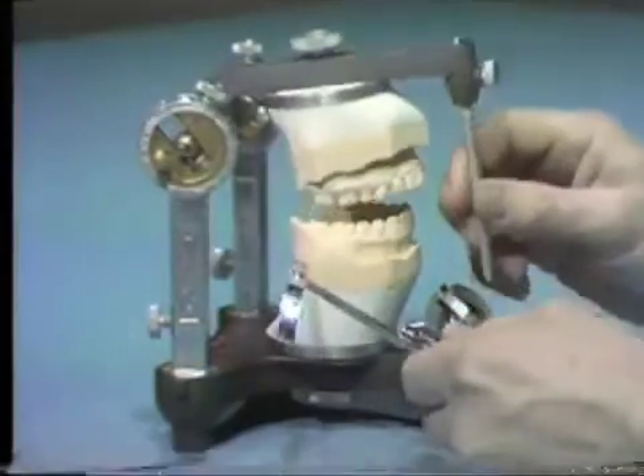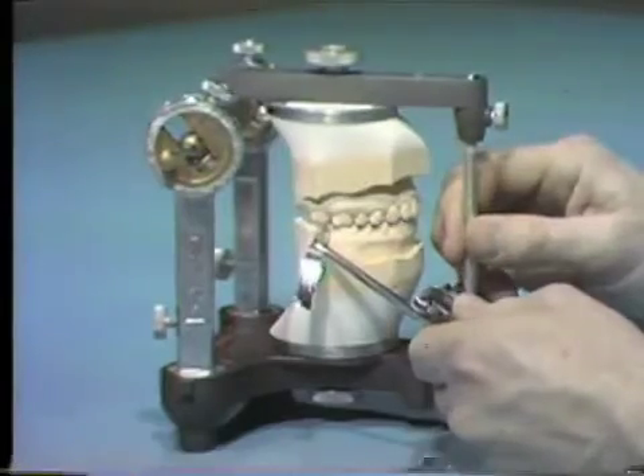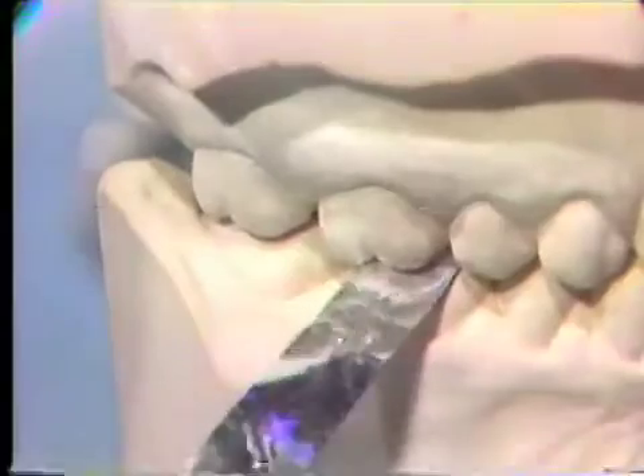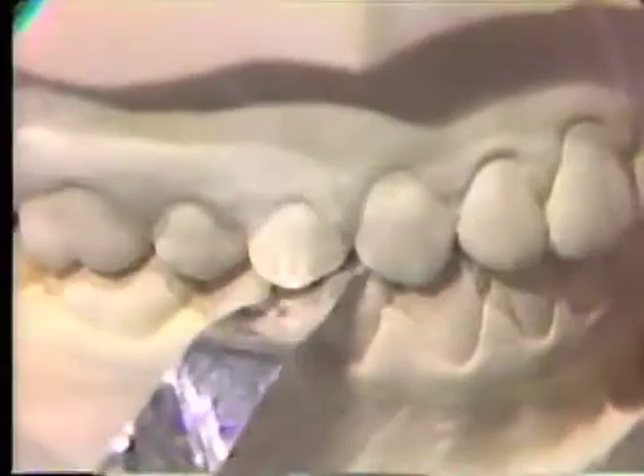To verify the accuracy of articulated casts, the centric occlusion stops are checked with shimstock. A good centric stop will hold shimstock when pulled between the teeth. If shimstock is easily drawn between the teeth, contact does not exist. Check the maxillary right first molar, cuspid, and central incisor carefully since these teeth will be waxed into functional occlusion. All three teeth should have at least one centric stop.